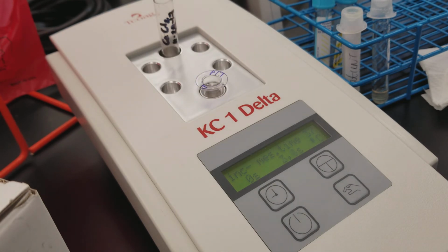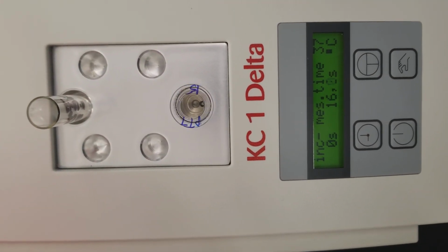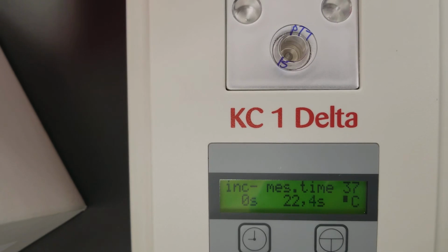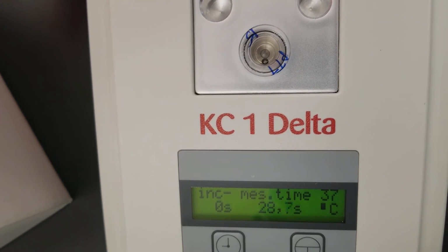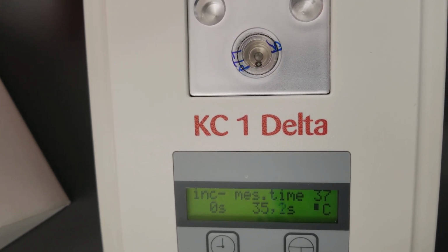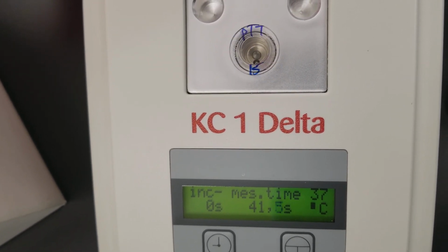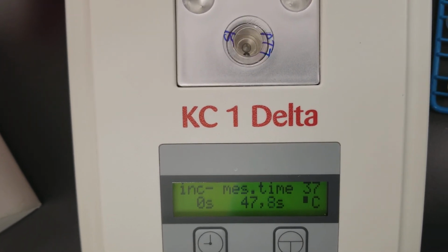Okay, we are getting good at that now, huh? All right, so even when it screams at you, it's still okay. So here, we'll see this again. Oh, if you're online, you're looking at it this way. Sorry about that. Let's see. I'm hoping that this one's going to be less than the other one. Again, 100 seconds for PTT is considered critical.